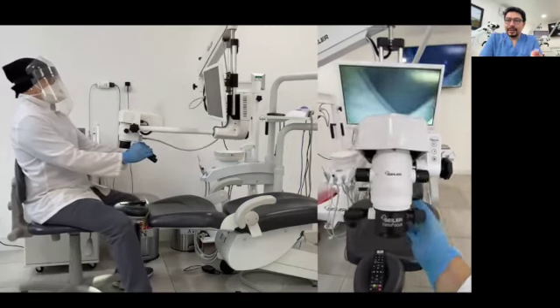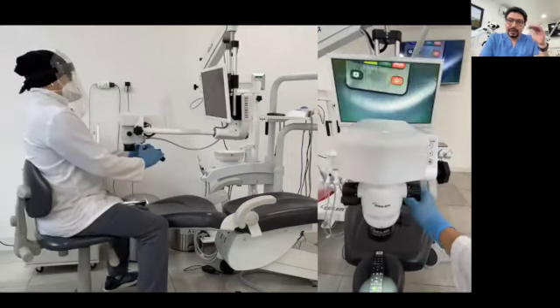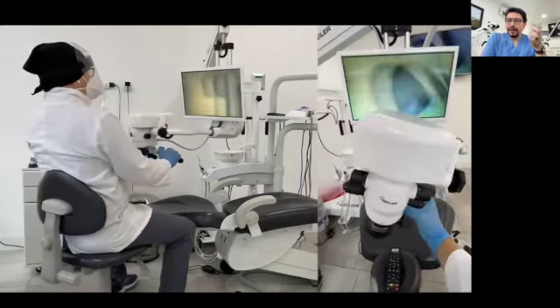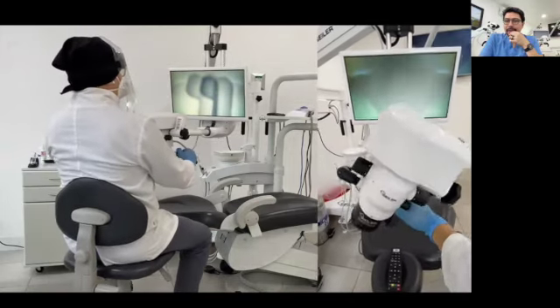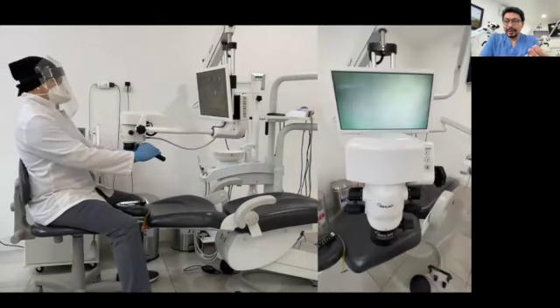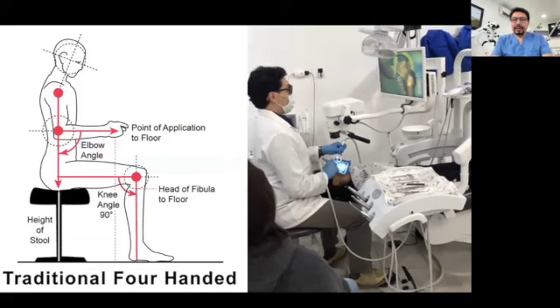What my students need to do when they work with it is just change the vertical position of the 3D microscope for having the best quality of images. And that's it, no parfocal adjustment needed for that. So it's quite simple and quite easy.